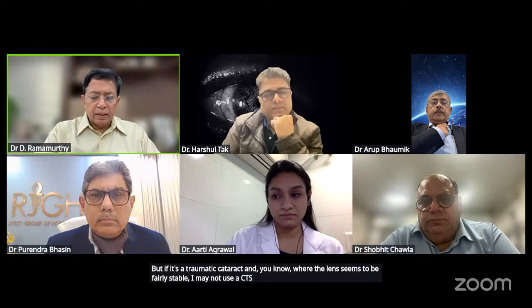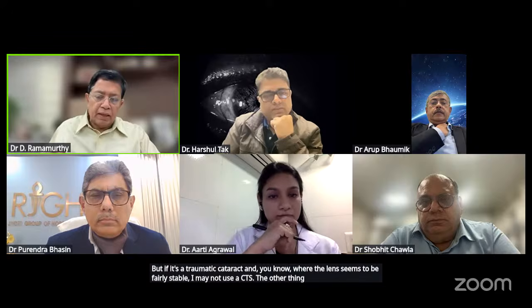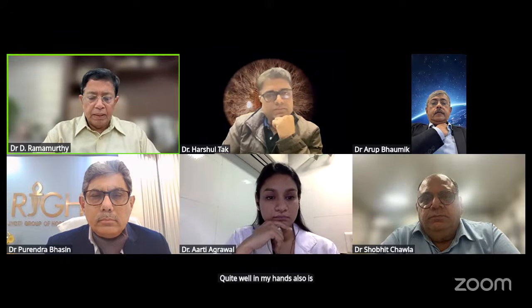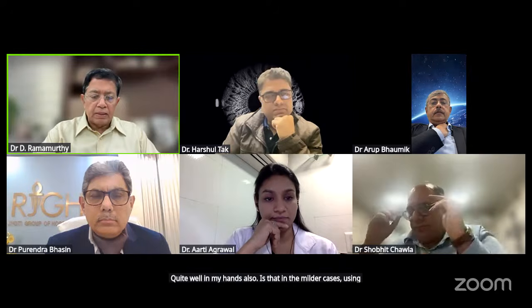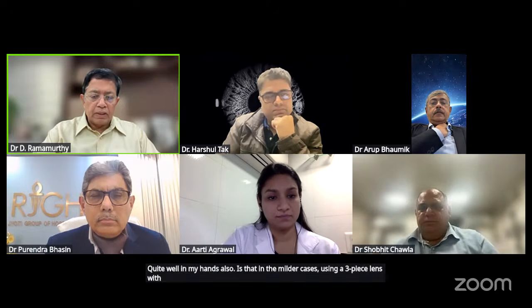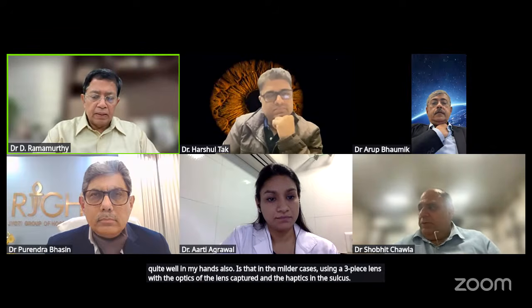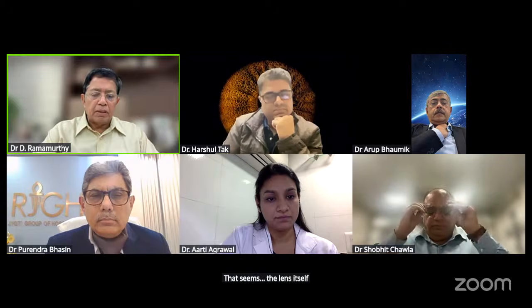And the other thing David Chang has propagated, I find that it works quite well in my hands also, is that in the milder cases, using a three-piece lens with the optics of the lens captured and the haptics in the sulcus, the lens itself seems to stabilize the bag quite well.